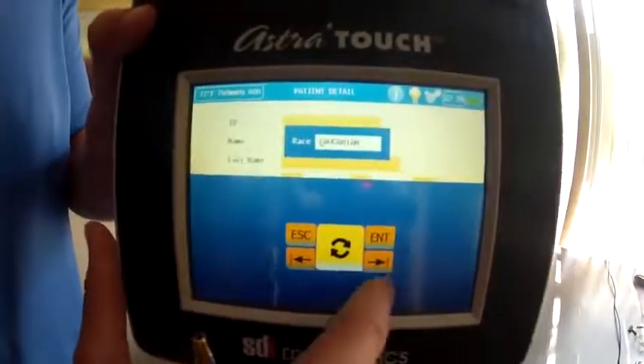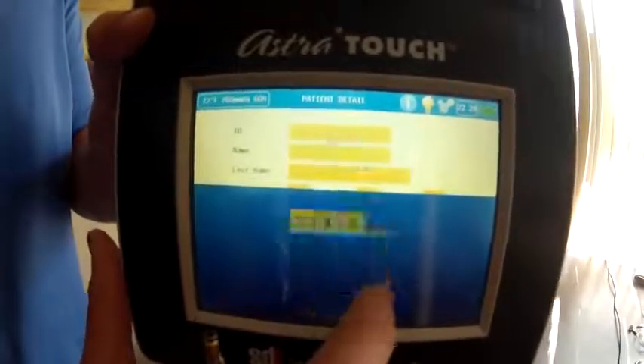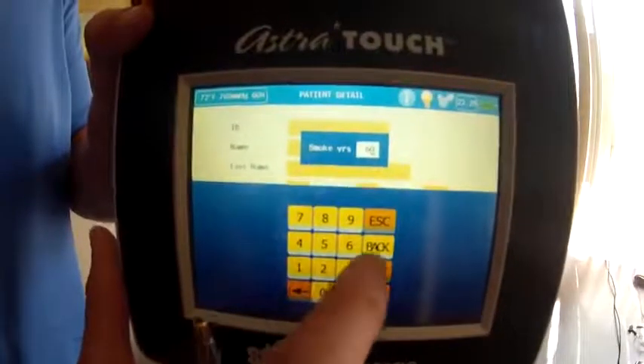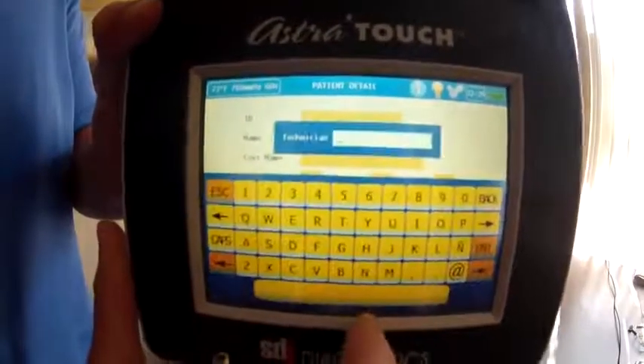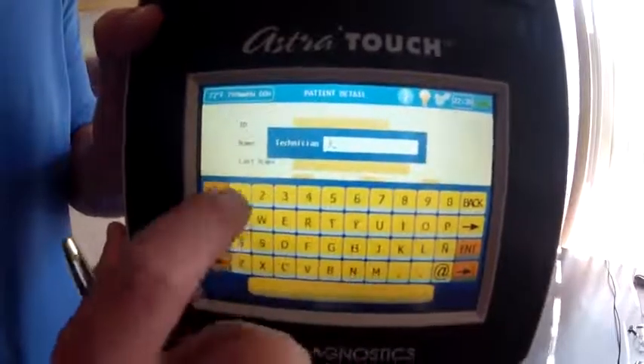Ethnicity factor: Caucasian. Male. Smoking years: zero. Smoking cigarettes a day: zero. And then for the technician, I'm going to put Jane.